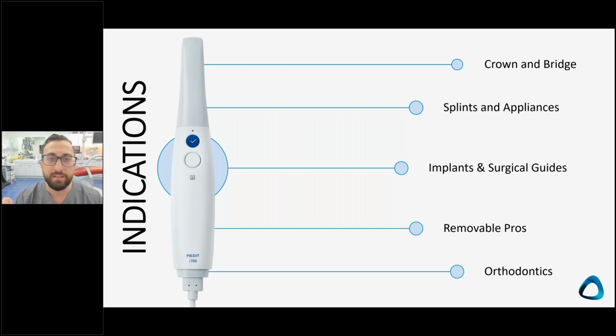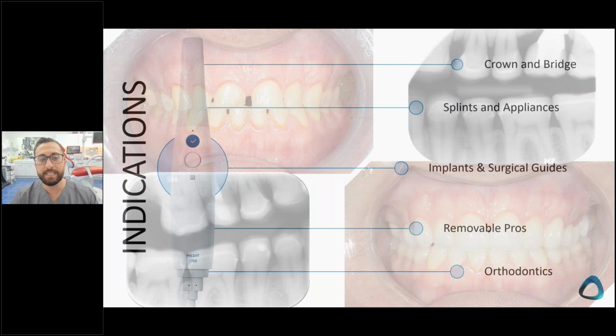The only thing that I really need to take an impression for these days is if a patient comes with edentulous ridges and I need to make them some dentures, because it's still key to get a functional impression, and I would take an impression, but I would then scan that same impression. But everything else I'm using a scanner for. I literally don't use impression material in my practice anymore. And you can see how well it works.